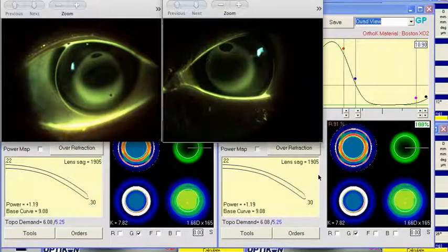This is an orthokeratology case that we had previously visited, initially for some complaints of glare at night and some residual astigmatism. Some new lenses were redesigned with asphericity to increase the treatment zone, and that resulted in lenses that are uncomfortable for the patient to wear. So the patient did revert to initial lenses, and this time around, this iteration, we're looking at trying to mostly tackle the vision part of the case.